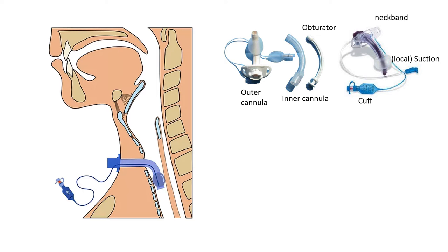Okay, then all of these also have to come with a neck band. If you're not wearing your neck band right now, then you have to hold the tracheostomy in place with your hands.